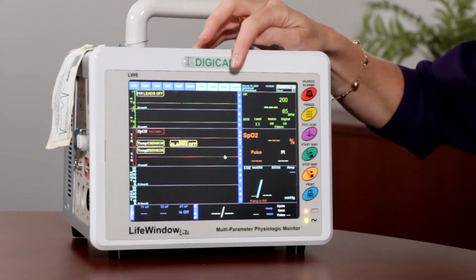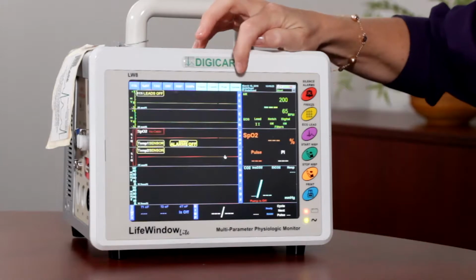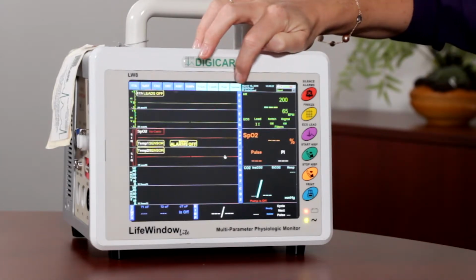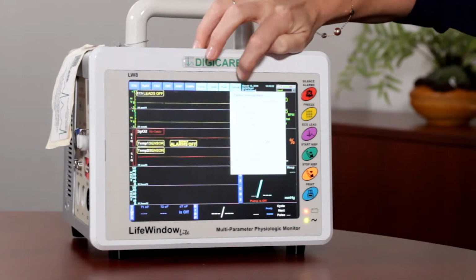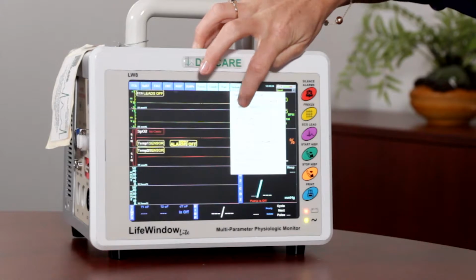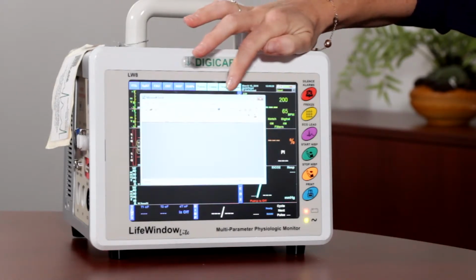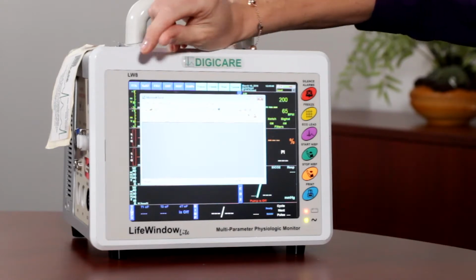Now we're going to view Reggie, our patient, that we saved as an Excel report. So there are a lot of things under system, but right now I'm focusing on how to view the Excel report. So you just want to hit system, view Excel reports, and this looks very similar to a computer, just like an Excel report on a computer.